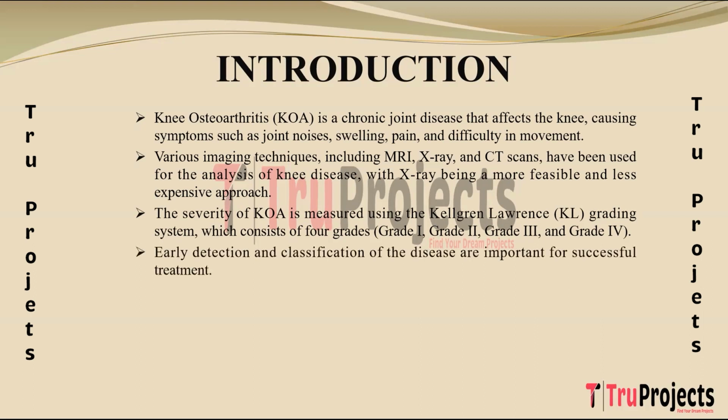Early detection of KOA, knee osteoarthritis, is critical for initiating timely interventions and treatments. Early stage management strategies such as lifestyle modifications, physical therapy, and medication can potentially slow down disease progression, alleviate symptoms, and improve overall joint health. Additionally, it allows healthcare providers to plan appropriate care and prevent potential complications associated with advanced stages of KOA.